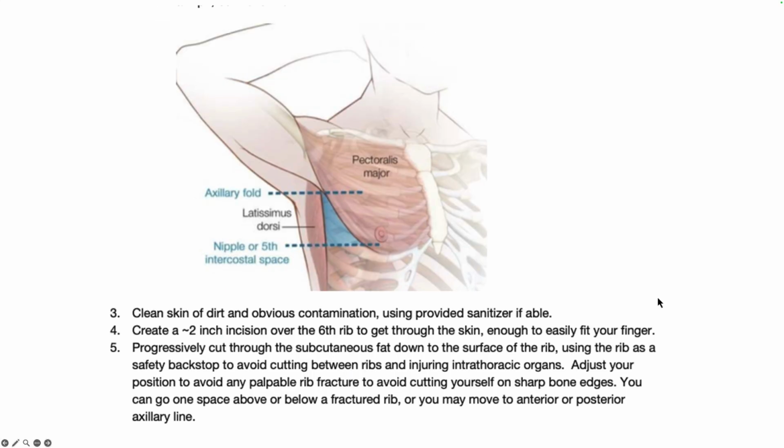Now, we have the provided skin sanitizer. If able, use that to clean off the patient, but speed is going to be the thing here. Obviously, if there's dirt and obvious contamination, clean that off. We don't want that inside the chest. But basically, this is a clean procedure, not a sterile procedure.